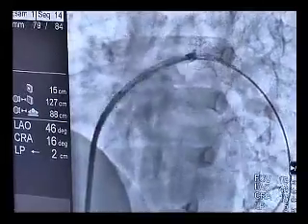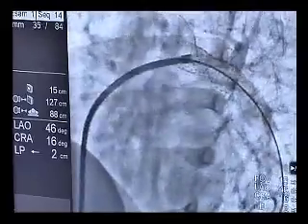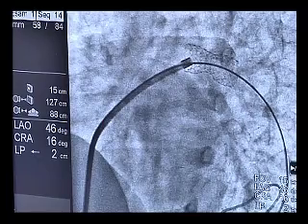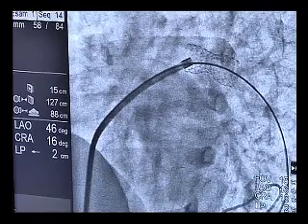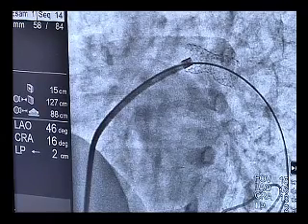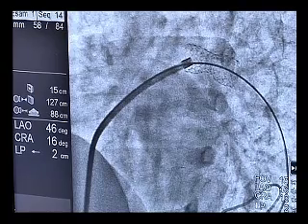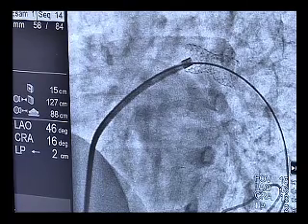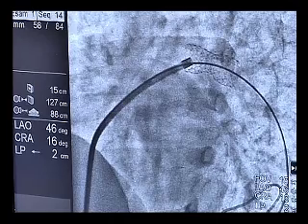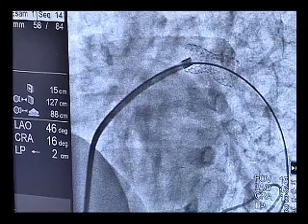So the choices would have been to use the cutting balloon first. Do you have the surgical history? Do you know how this was connected? Okay. Do you think it could be good to redilate using a high pressure balloon 10? It could be an option. We can try to resolve the waist inside the stent using a 10 millimeter high pressure balloon. It's your choice here what to do.